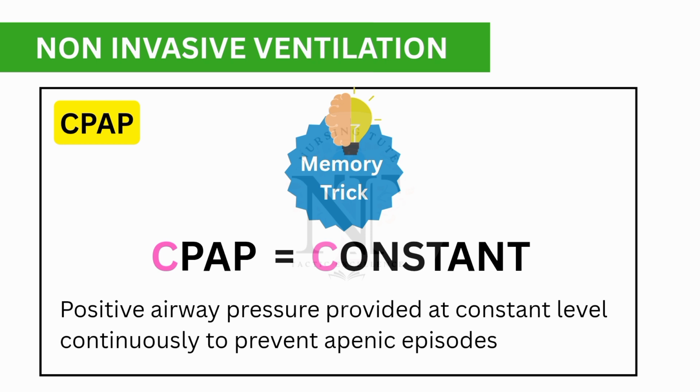The memory trick is CPAP, right? It starts with C, so think of constant. Positive airway pressure provided at a constant level continuously to prevent apneic episodes.